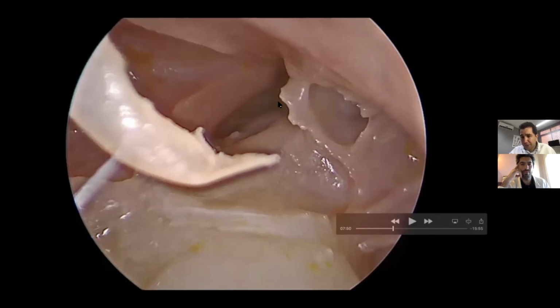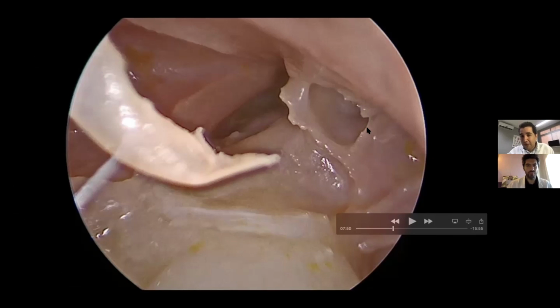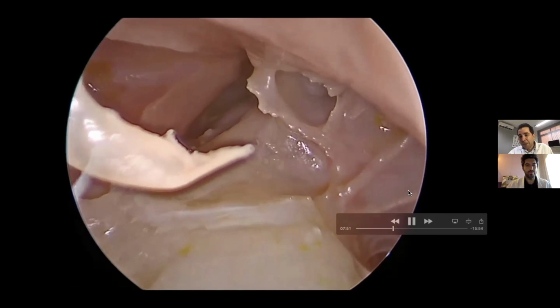It's like the first bone crest of the protympanic area that can direct you towards the carotid artery. So the protympanic spine is this first bone crest, and as you can see, it's like the crista ethmoidalis that can lead you to the sphenopalatine artery. So this is the protympanic spine that leads you to the internal carotid artery. So it's very nice. And also this is a division from the protympanic area to the hypotympanic area, which is going to be down here.